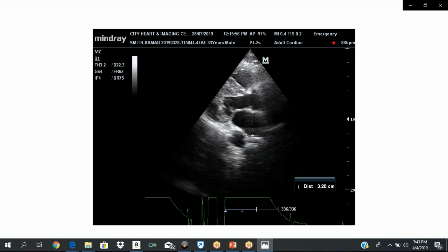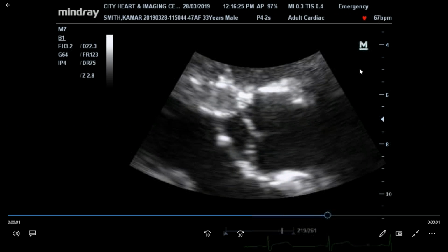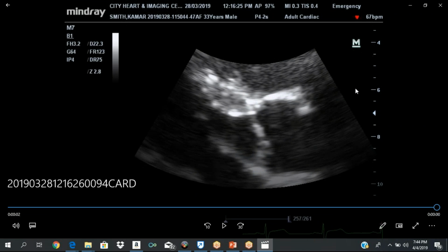So the only way you're gonna be comfortable with scanning is by practicing. It's not something that you can read a million times. This is something you have to practice. Again, if you need to look at stuff, you can zoom it. When you zoom, you enlarge the area of interest.